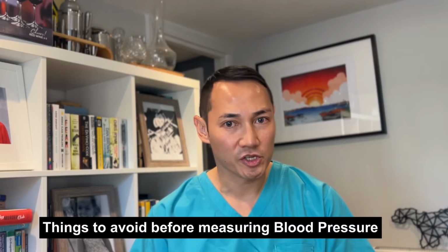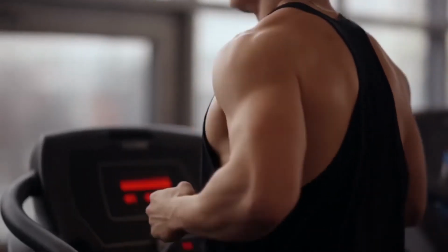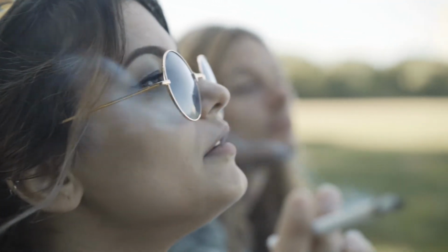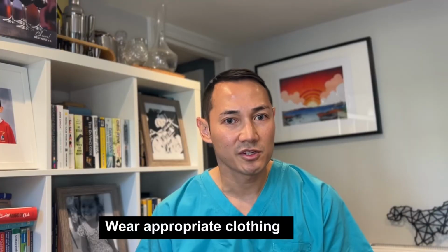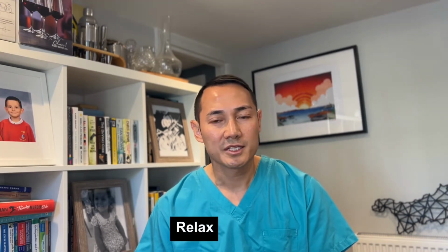Before taking blood pressure, you want to avoid things that can raise blood pressure, such as recent exercise, eating within the past half hour, drinking coffee, smoking, or even feeling the need to go to the toilet. You want to wear a t-shirt or something a bit loose with just one thin single layer. You want to rest for about 5 minutes so you're feeling really relaxed and comfortable before taking blood pressure.